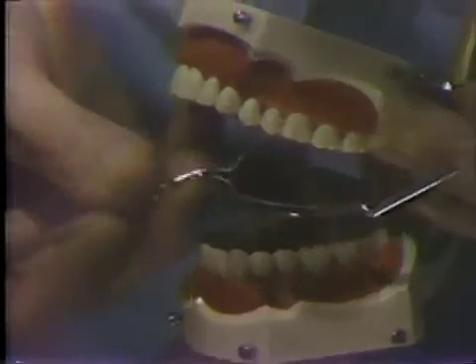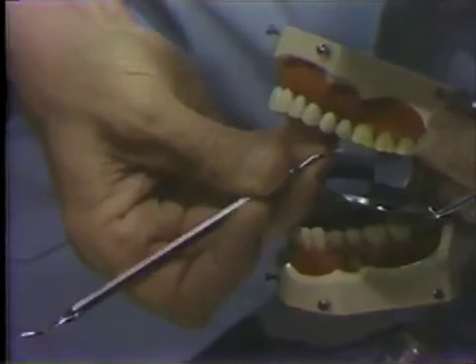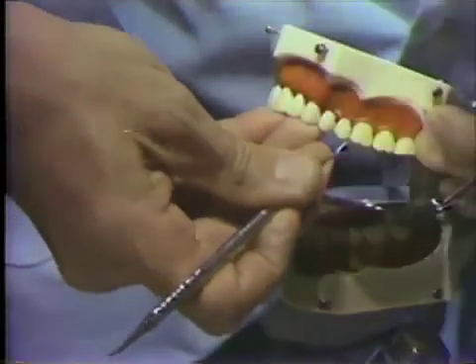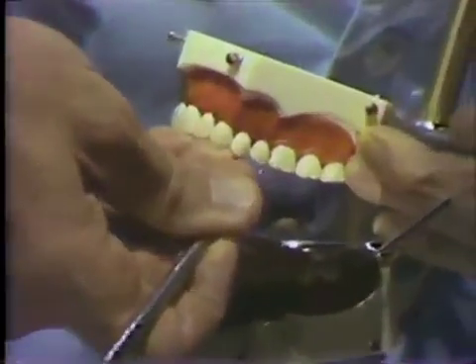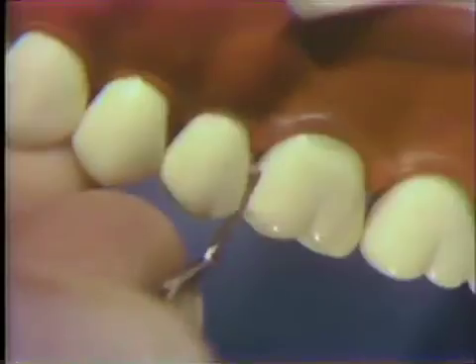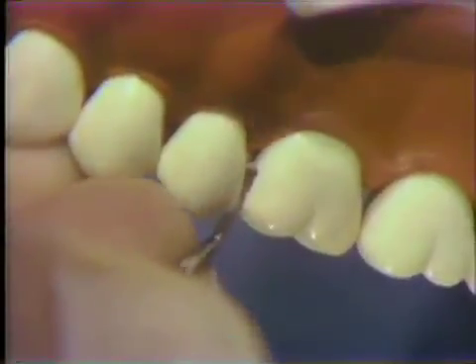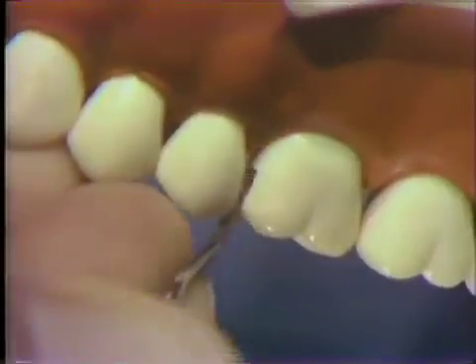Switching to the 10-6-8 chisel and positioning with an inverted pen grasp, it is possible to plane the proximal walls with good visual access, following the same format — the instrument in the plane of the wall, moving down the wall in a cervical direction, utilizing the mirror view.